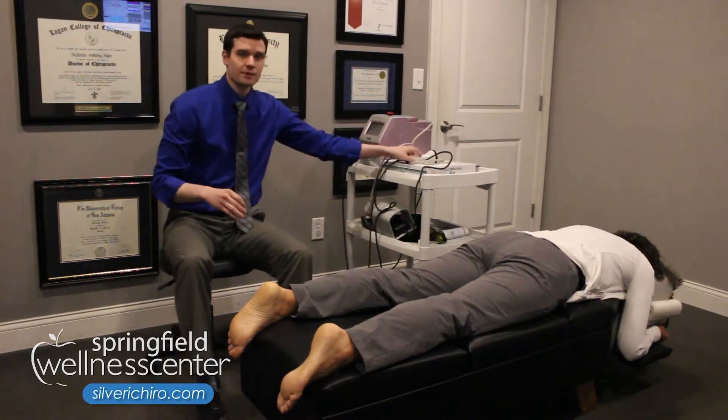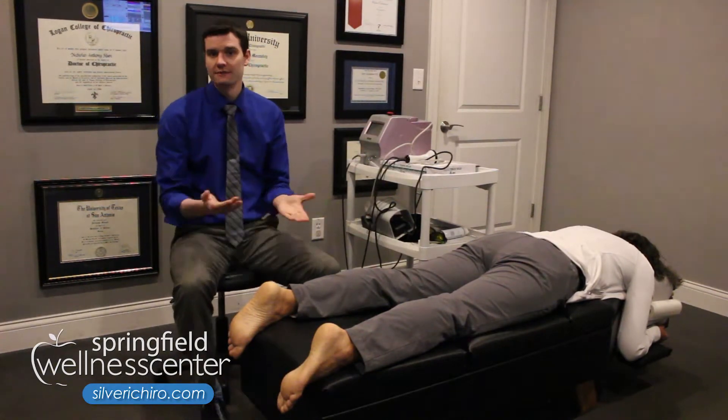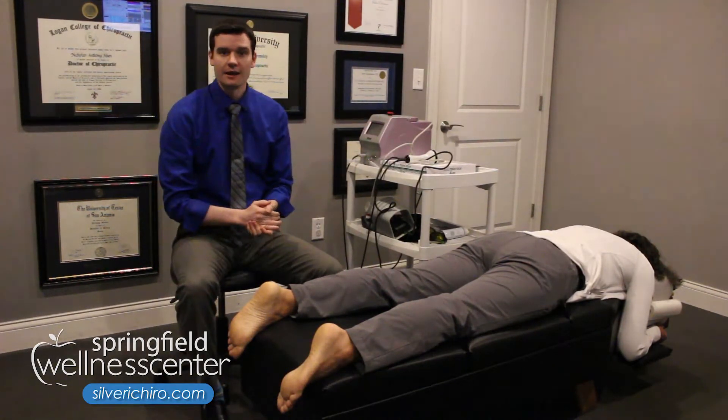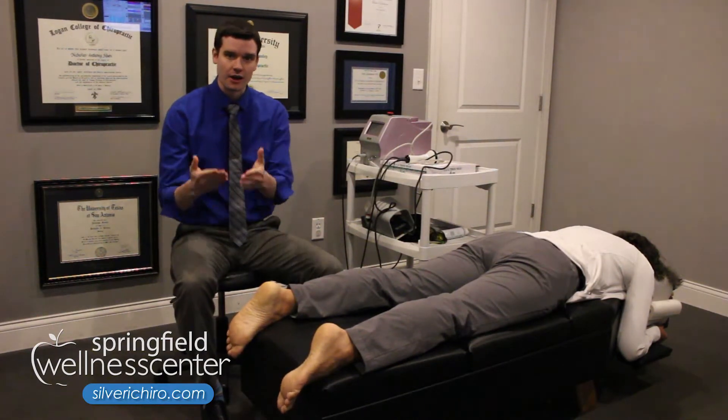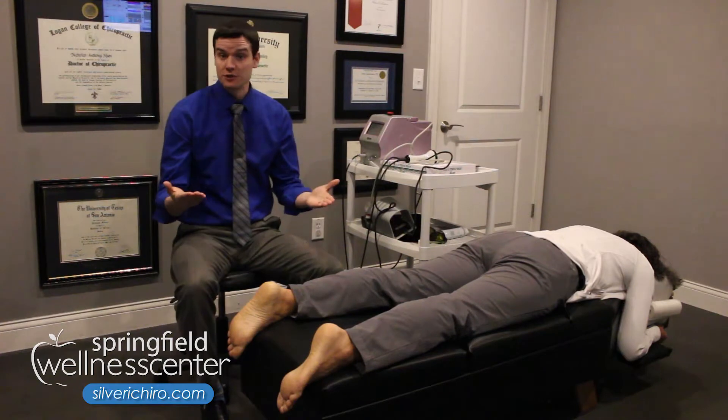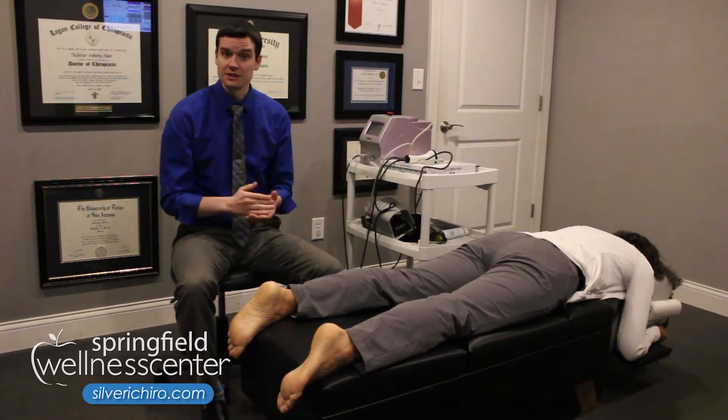When we do this therapy, it takes anywhere from three to five minutes or so for treatment. And it helps to stimulate that energy production and tissue healing processes on the bottom of the foot. So if you're interested in laser therapy, please give us a call.